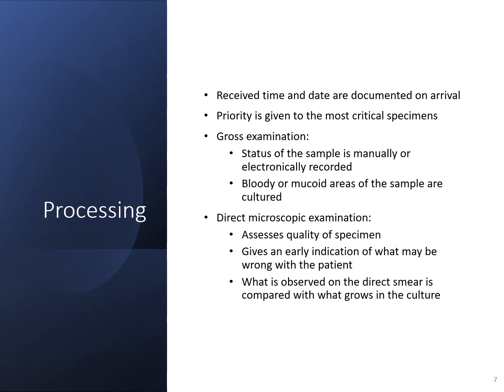With a direct microscopic examination, you're preparing a slide directly from the specimen source. For example, a sputum culture would come in a cup with the sputum actually in the cup. So you would make a slide off of that sputum sample. You would roll that onto a glass slide. Rather than taking it directly from the culture and looking at the organism, you're looking directly at what came from the patient.